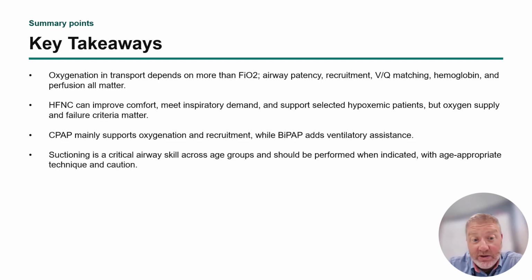High flow nasal cannula can improve comfort. It can meet or exceed a patient's inspiratory demand, and it can support selected hypoxemic patients, but a lot of things need to be taken into consideration, like whether it's a fluid issue, whether it's a ventilation issue. But for high O2 needs and increased work of breathing, high flow is a good place to start.